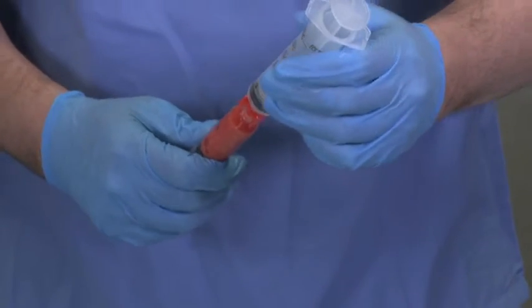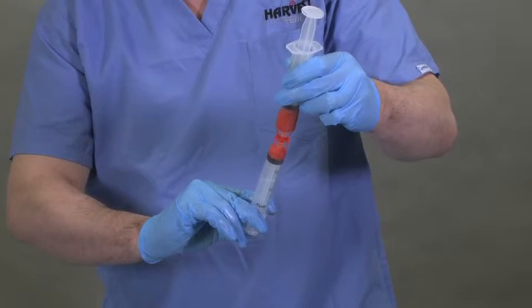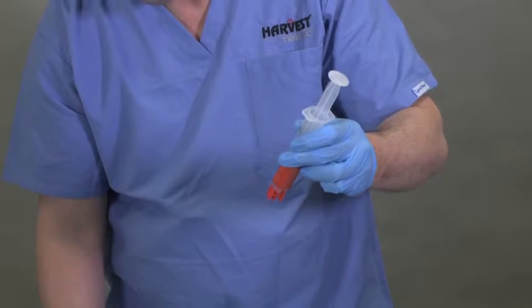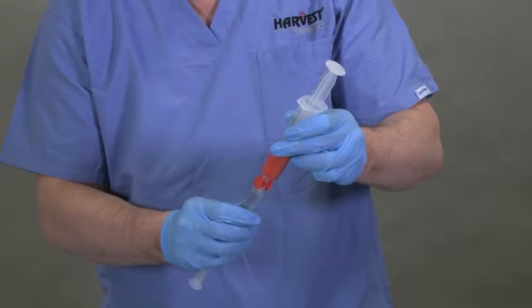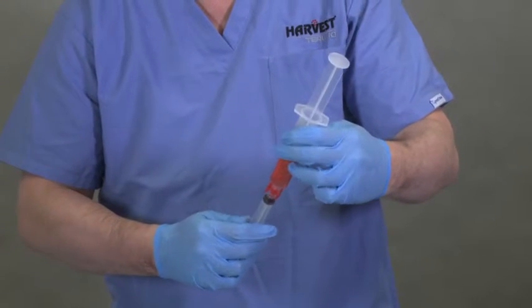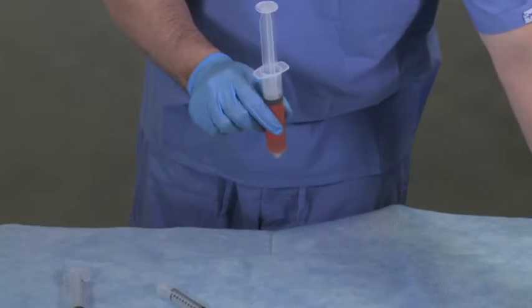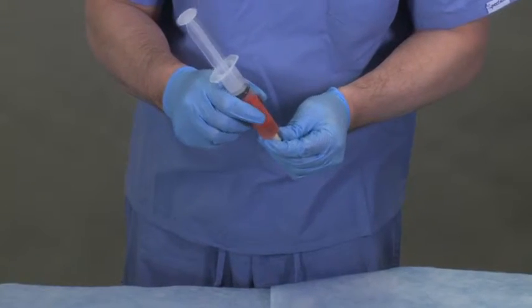Attach a female-to-female connector to the first collection syringe and connect to an empty sterile 30 milliliter syringe. Position the connected syringes so the collection syringe is on the bottom, vertical to the sample syringe, and expel the lipoaspirate solution into the empty wash syringe. Fill a separate 10 milliliter syringe with 8 to 10 milliliters of sterile saline. Connect the syringe containing saline to the wash syringe via the female-to-female connector, position so the saline syringe is on the bottom, and expel the saline solution into the wash syringe. Place a tip cap on the wash syringe and invert the wash mixture 3 to 5 times.